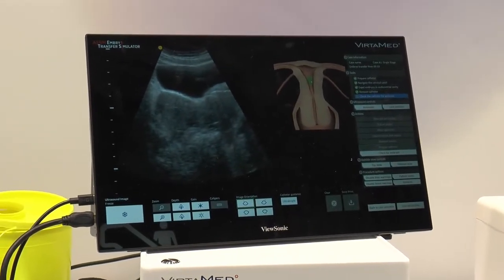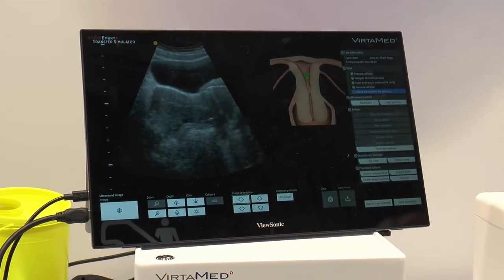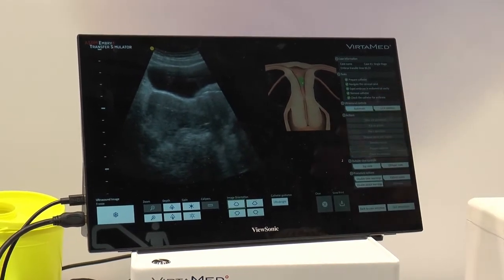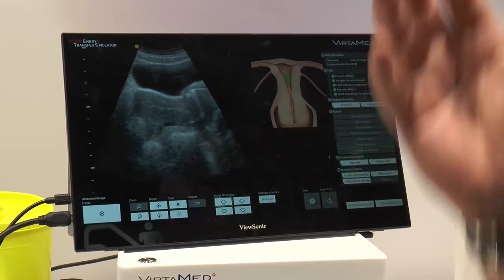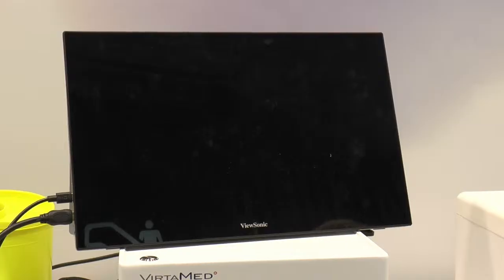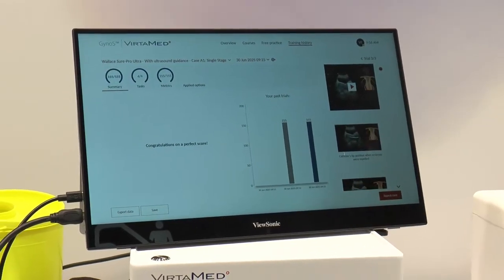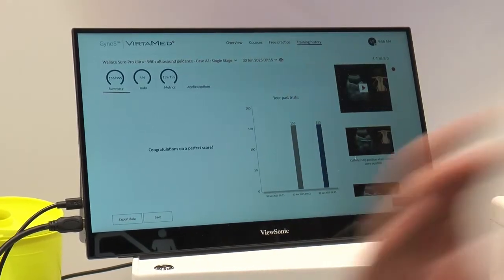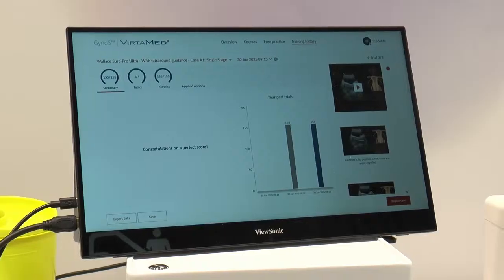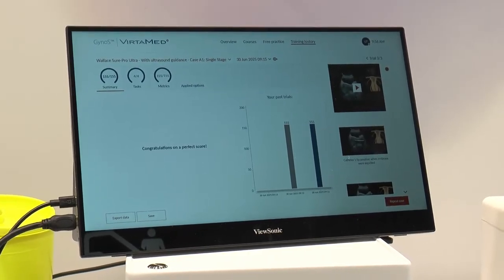Thank you. And now we have to check for retained embryos. We're not really checking, but it's telling us that we always need to do that. Once we press that, the simulator does the calculation, and it's going to give me a score and see how well I did. So it will record what you do every time. So here, unremarkably, I got a perfect score. And if all patients were like this, we'd have no trouble.